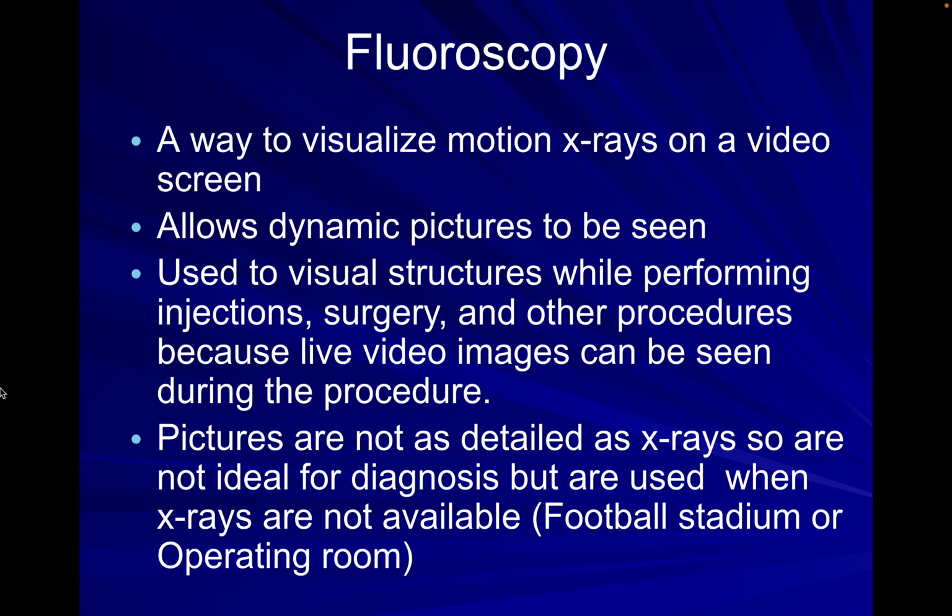That brings us to fluoroscopy, which you can think about as X-rays in motion, so dynamic X-ray style pictures that are often used during procedures like an injection, a surgery, or at the point of care after a reduction of a dislocated bone or fractured bone. And the perk, or the benefit, is the live video images that you can produce.